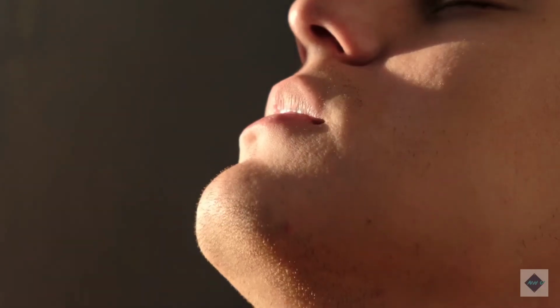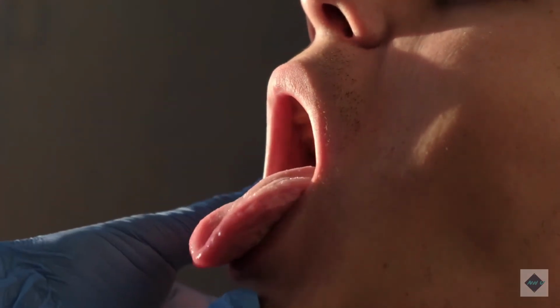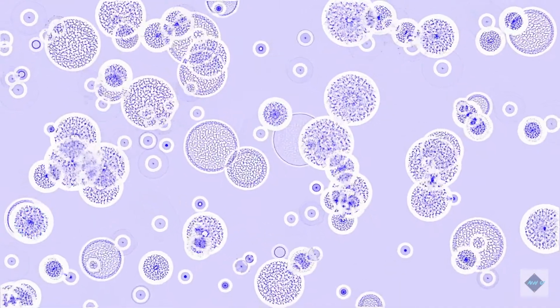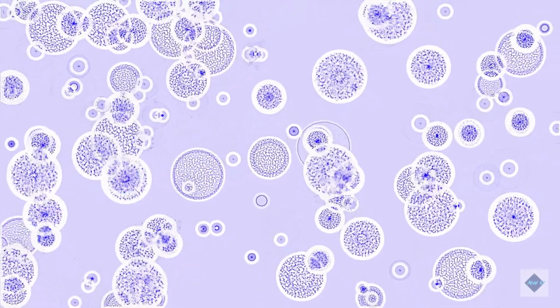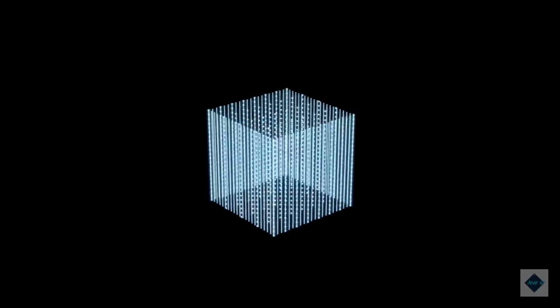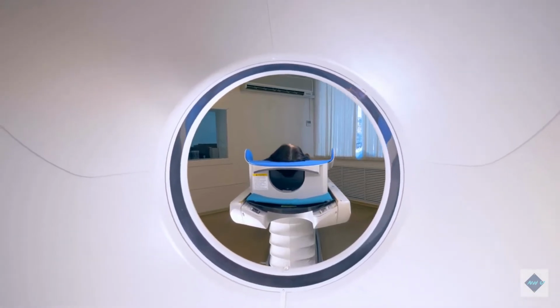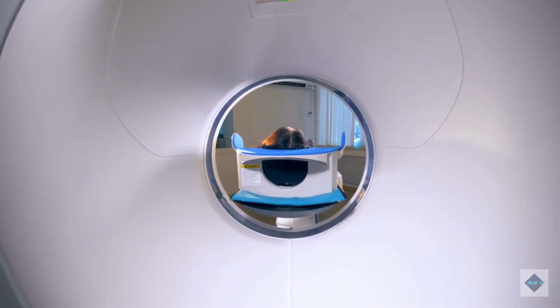With their greater degree of visual discrimination, the pseudo-multispectral images clearly resolved porphyrin clusters on the skin and within the oral cavity. In addition, though they tailored this method to show porphyrin, researchers could modify the image analysis pipeline to detect other bacterial signatures that also fluoresce under LED. That is the beauty of this technique. We can look at different components simultaneously, said Wang. If you have bacteria producing a different byproduct that you want to detect, you can use the same image to look for it, something you can't do today with conventional imaging systems.